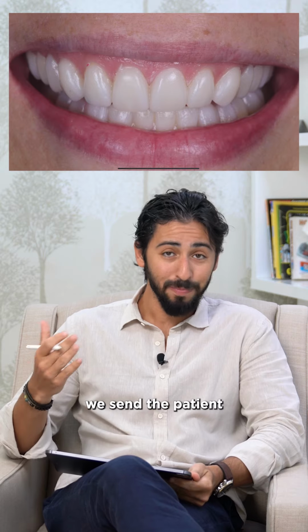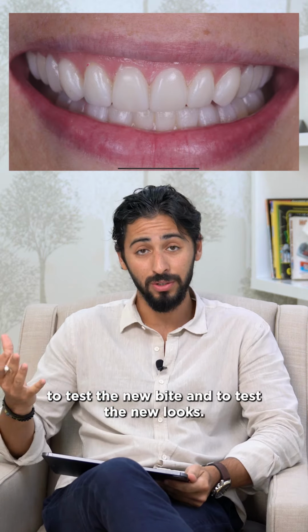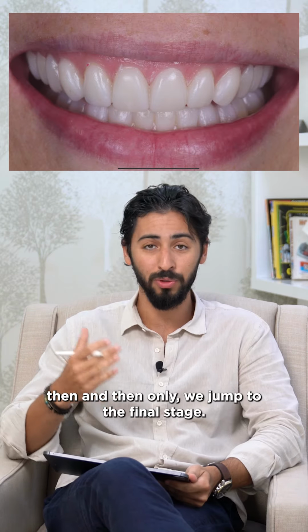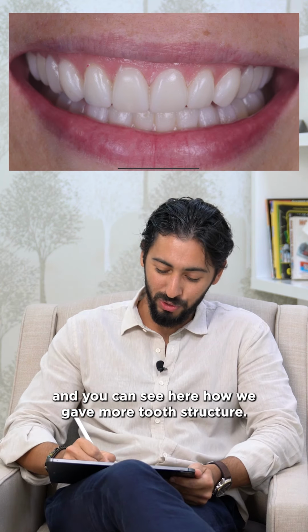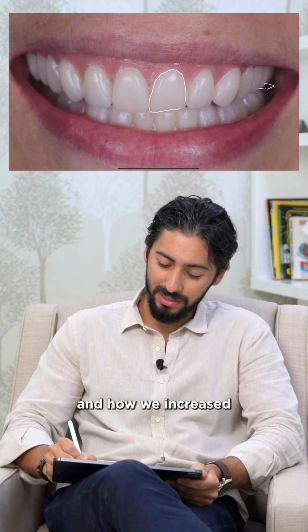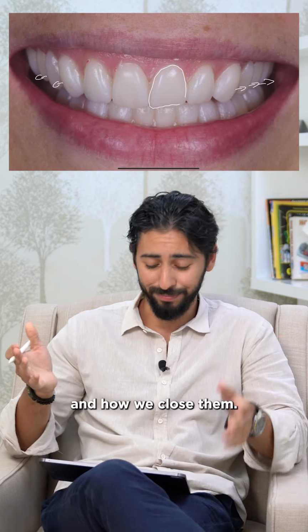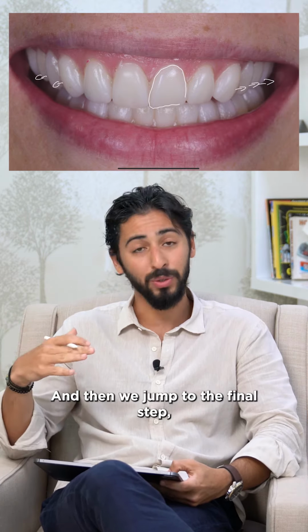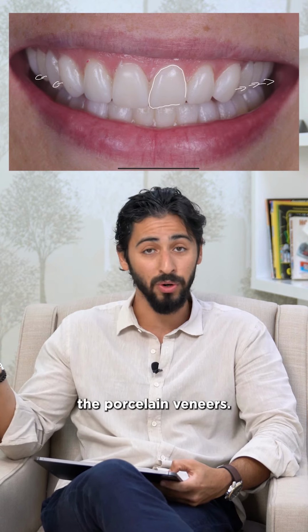We send the patient with those temporaries for 2 weeks to test the new bite and the new looks. And afterwards, once we approve that, then and only then we jump to the final stage. We can see here how we gave more tooth structure, more volume to the teeth in this area, and how we increased what we call the buccal corridors on the right and the left side, how we close them. After approving the shape and the size of the teeth, we jump to the final step, which is cementing or inserting the porcelain veneers.